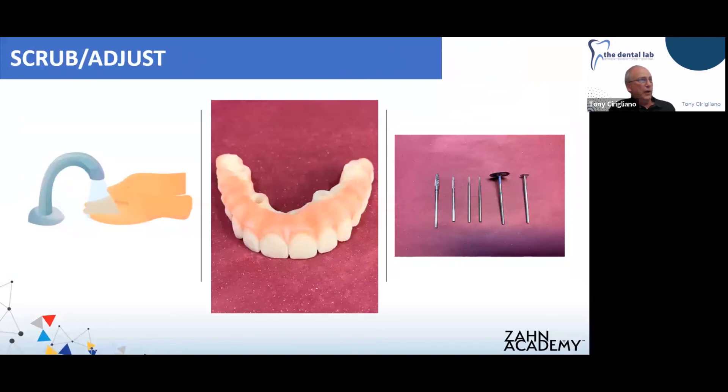After the cure, we scrub off that layer of barrier gel. This is the bridge right out of the curing unit — you can see the characterization, the different shades of pink, the darker pink interdentally, the lighter pink at the free gingival margin. You can also use the lighter shade on a root eminence area. There's also a clear material that comes with the kit that might be useful for creating some depth of color. It's just a matter of preference — experiment with the kit, see what's best for you, see what your doctors like.